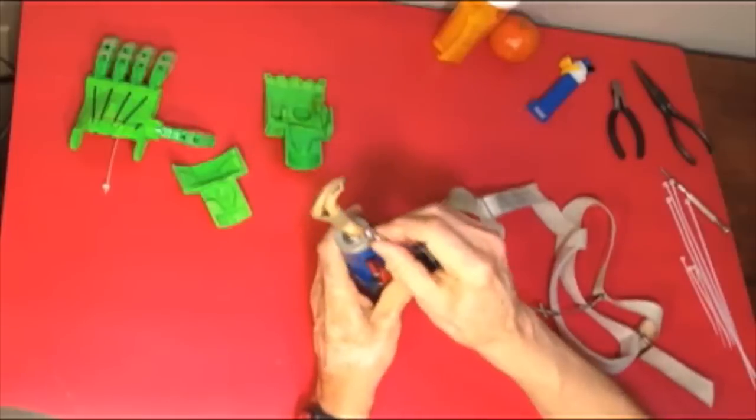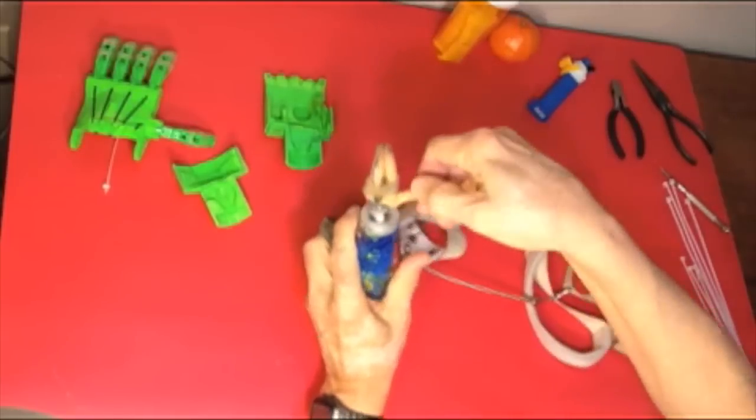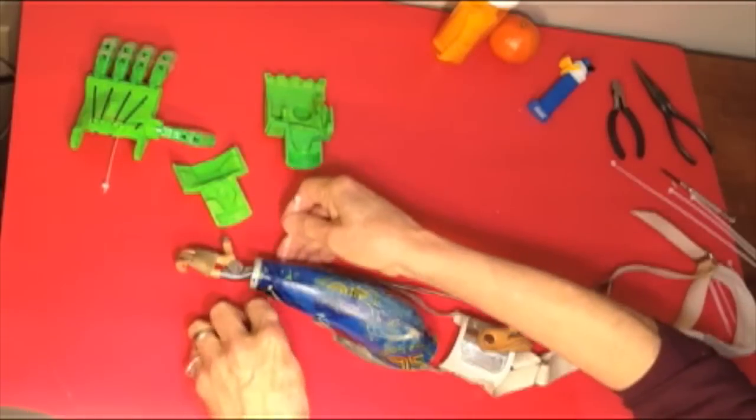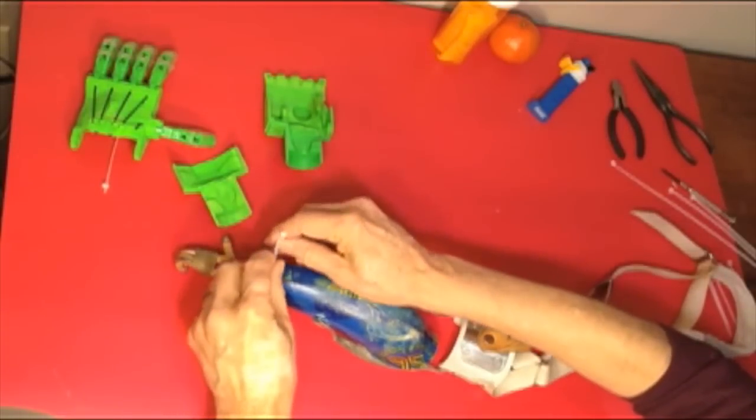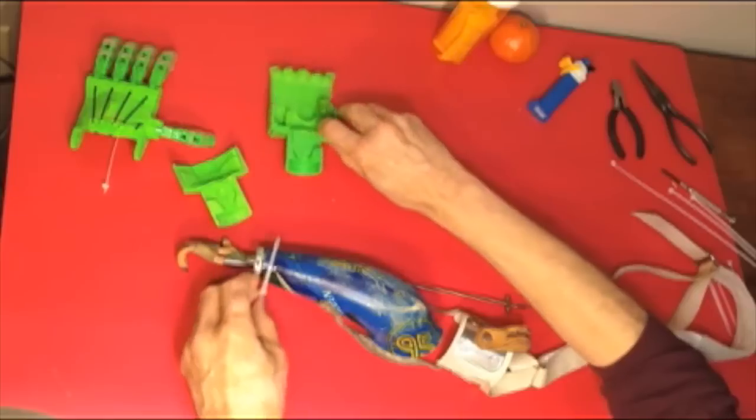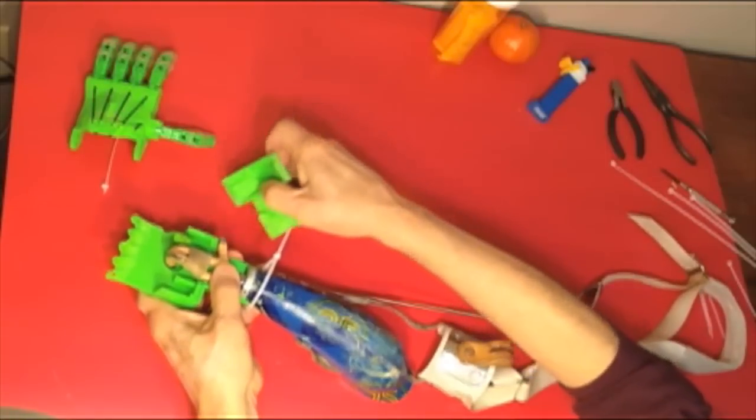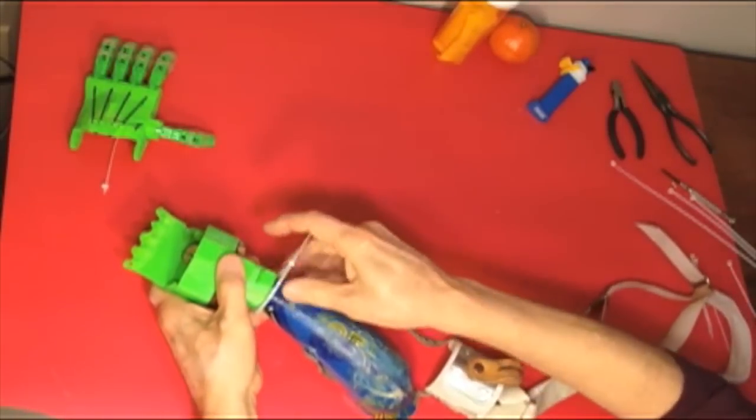The hand on Wilhay's prosthesis is an Enable Raptor hand that is normally fitted on a gauntlet strapped to the forearm of a person who has a functional wrist and a hand with missing fingers. Bending the wrist pulls the strings that flex the fingers for gripping things.